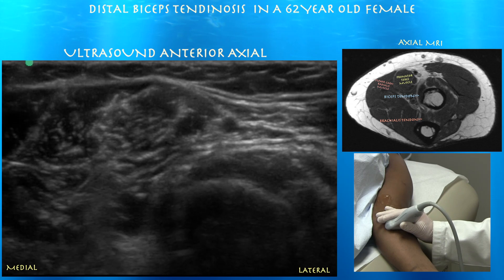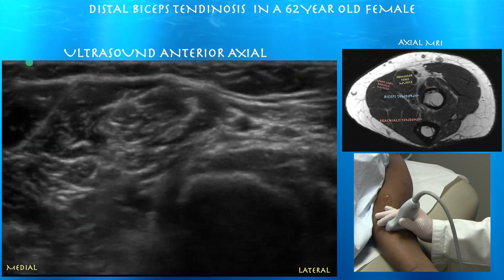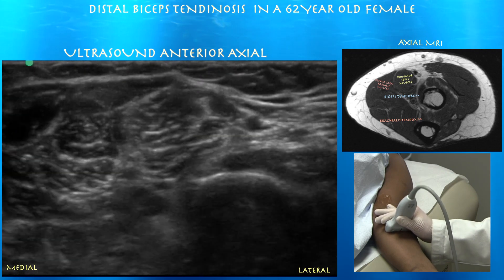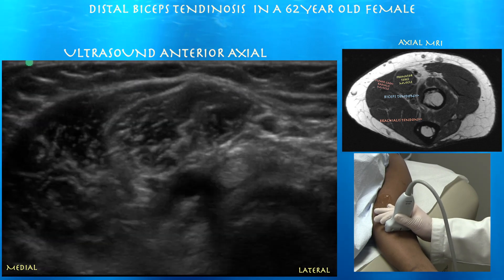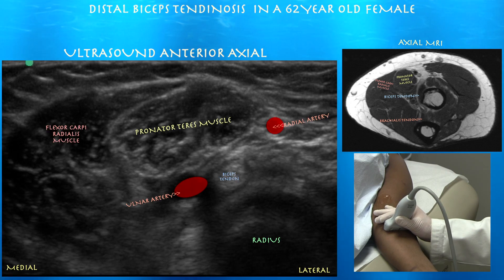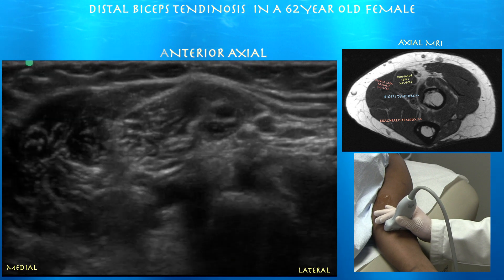Toggling the view again to visualize the tendon — let's see if we can go even deeper. Now it's inserting on the radius; you'll really start to lose it in the deeper planes. Here you can see the biceps tendon near the radius with the ulnar artery medial and the radial artery superficial to the biceps tendon.